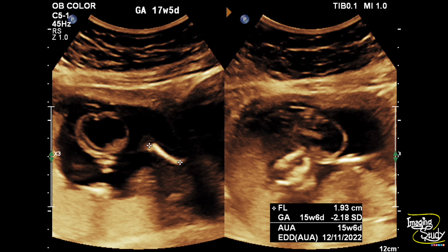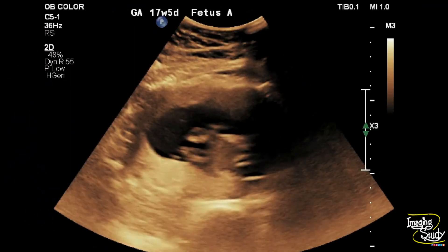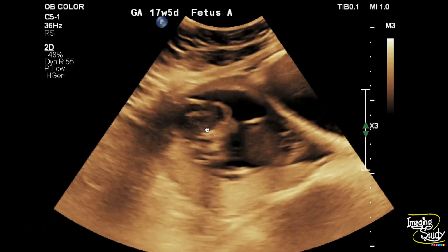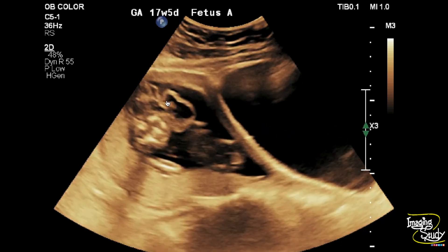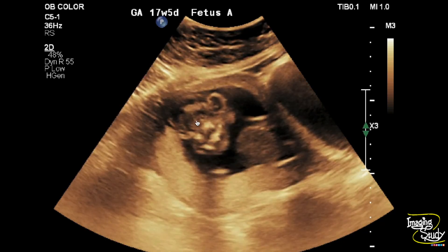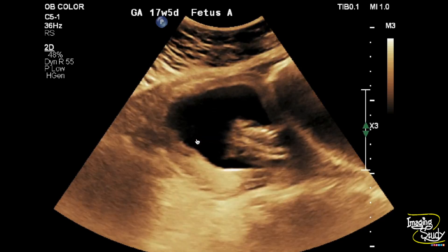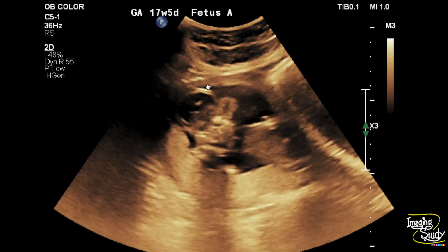Let's see on real time. Here on real time you can see a complex cystic area which is an outward herniation of the brain matter along with fluid and meningeal covering. It is connected to the cranial cavity via a defect at the parietooccipital region.